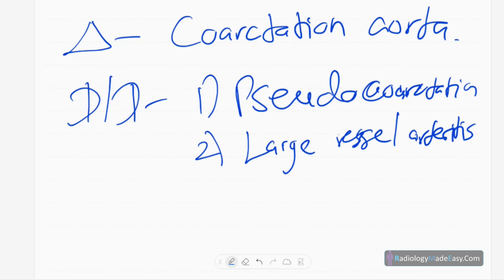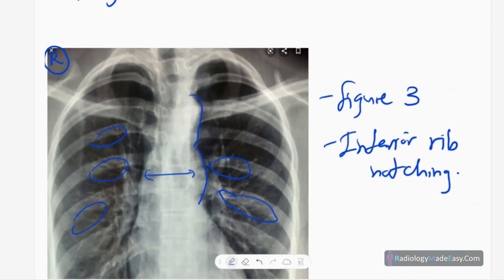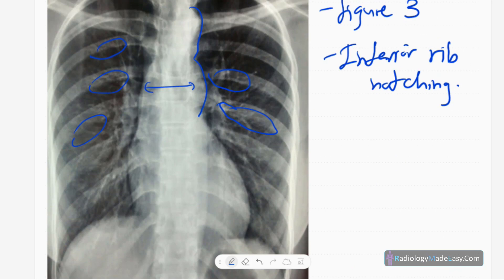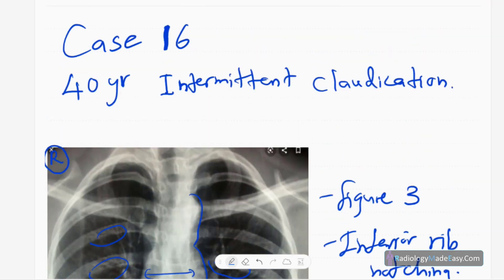In coarctation, the dilatation of the aortic knuckle region is due to pre-stenotic dilatation — proximal to the obstruction — of the arch of the aorta as well as the left subclavian artery. The lower part is due to post-stenotic dilatation, and together they construct the figure-3 appearance. Inferior notching of the ribs is due to compensatory collateral formation by the intercostal arteries. That concludes case number 16 of our RS series.